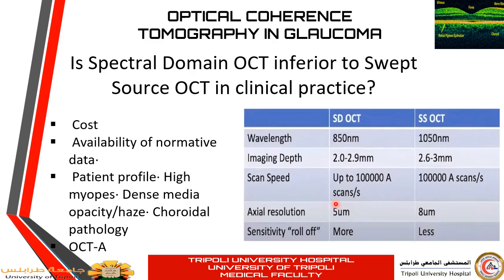However, there is another aspect, that is the cost. The swept source is much more expensive than the spectral domain OCT. And for the spectral domain, there is good available normative data for patients. However, for swept source, we lack the normative data to compare the patients.